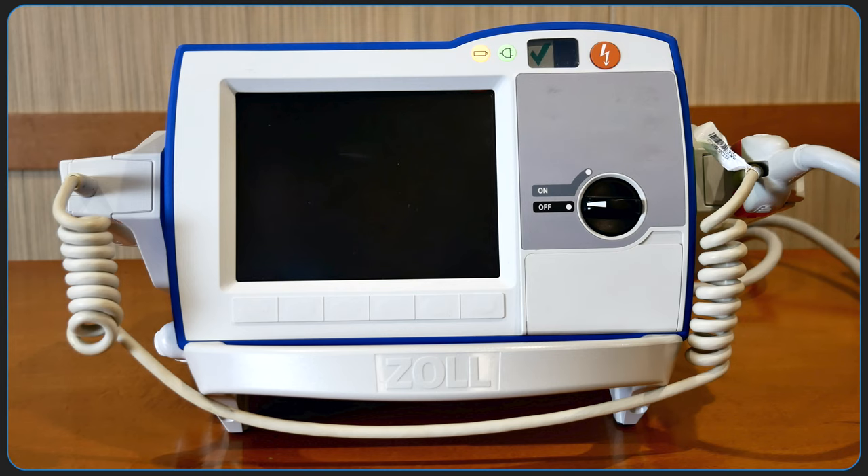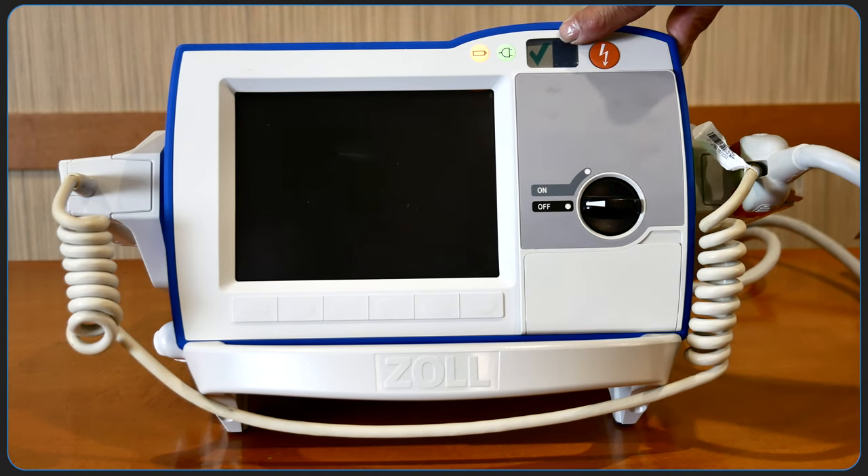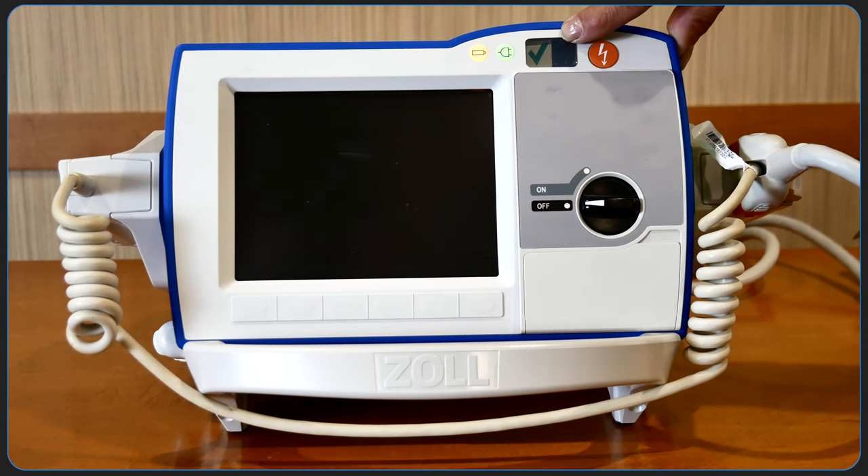This is the front display of the unit. At the top right is a code readiness indicator, which shows the status of the unit based on the most recent automatic overnight check. A red X does not prevent the defibrillator from being used, but biomedical engineering should be contacted.